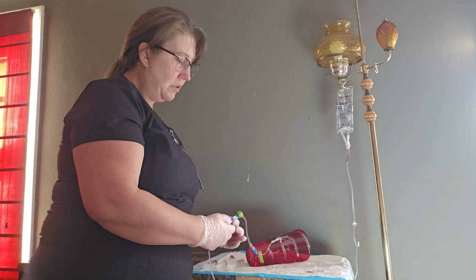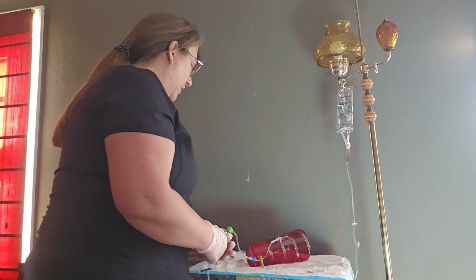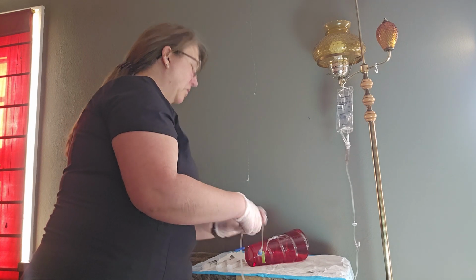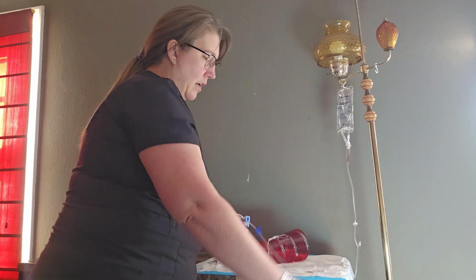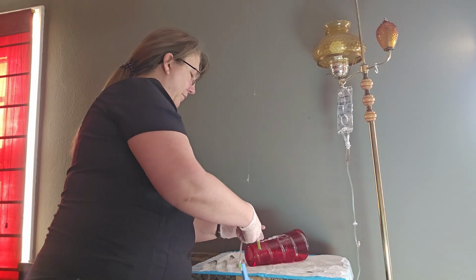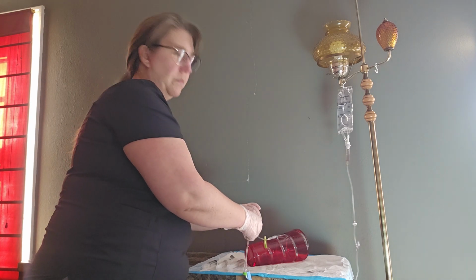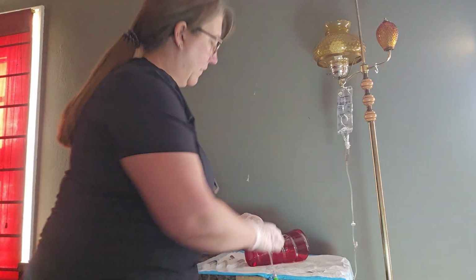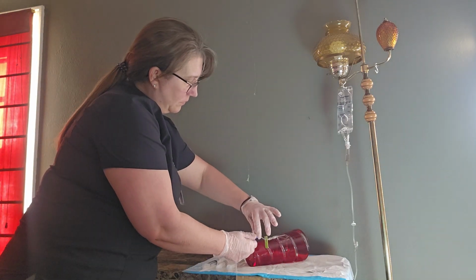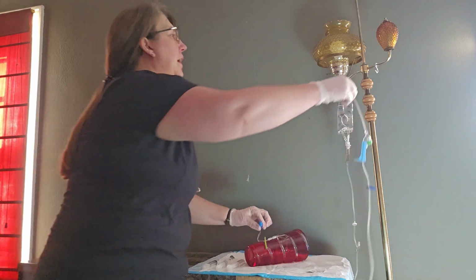So what we need to do is close the clamp. The clamp is closed. It has stopped the flow of the IV in the tubing. And I am going to unhook it and hang it right up here.